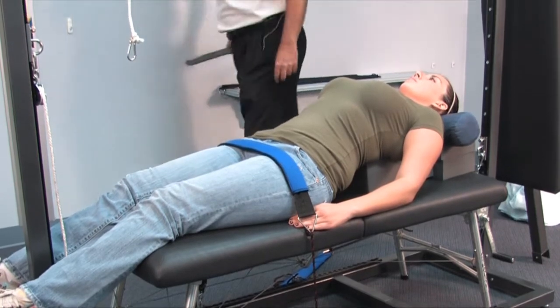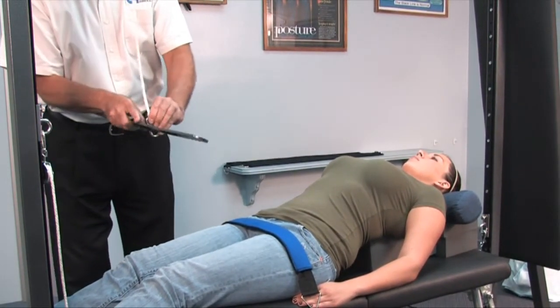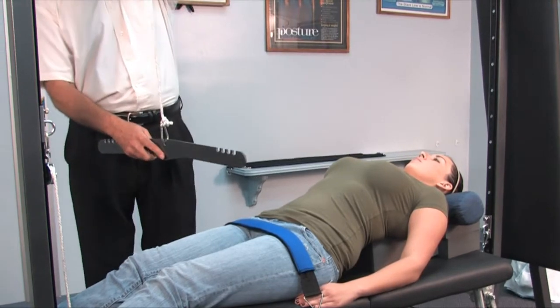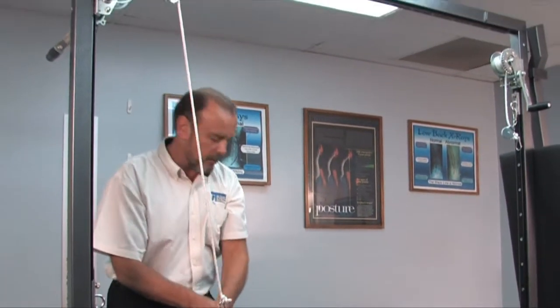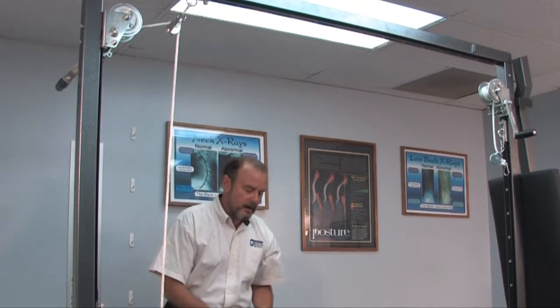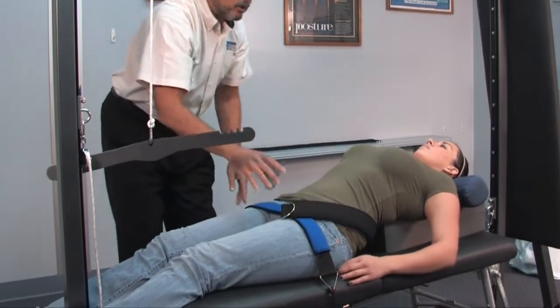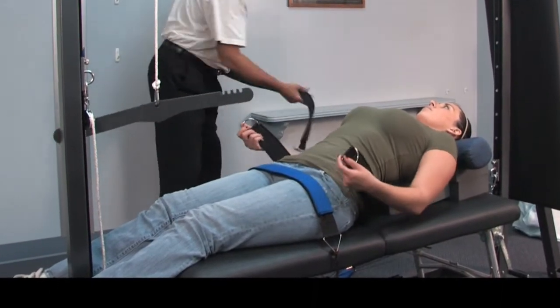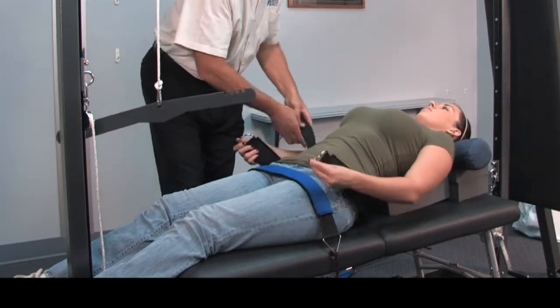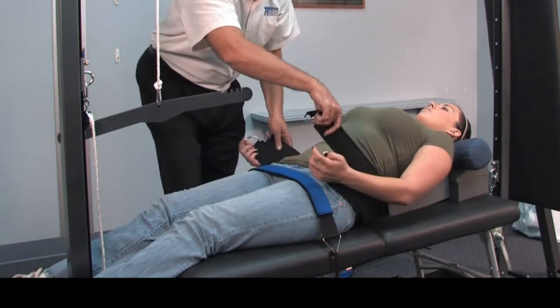Next we're going to take the more heavy-duty crossbar and hook that up. We're going to take the non-adjustable neoprene covered traction belt and place that behind her. Very often for the lumbar traction we'll use two of them, as they tend to be a little more comfortable for the patient. We'll hook those up to our crossbar.